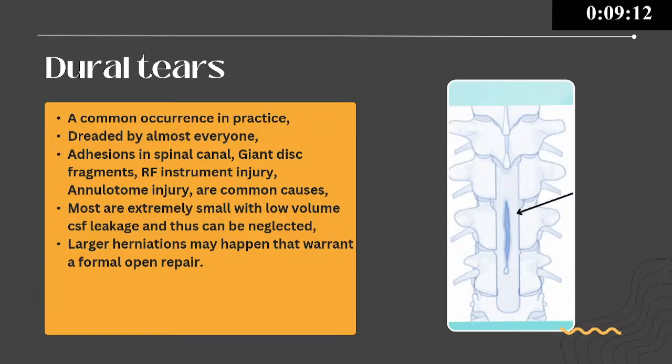Now, dural tears are notorious. They will happen, they can happen. And yesterday, when I was talking about Hoffman's ligament, I told you that most dural tears in endoscopy are not because of your instrument.